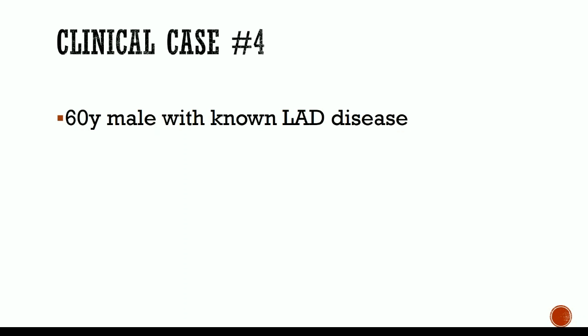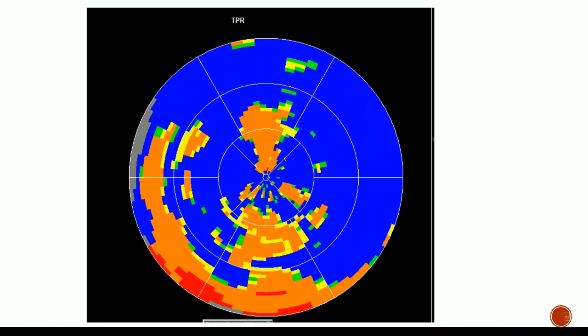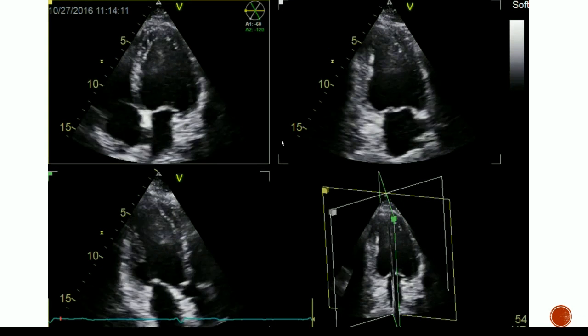This was a 60-year-old male with known LAD stenosis. This was his coronary CT angio, where, just beyond the diag of the LAD, we have some calcified segments in the area of severe plaque and severe stenosis right here. This is the CT myocardial perfusion Dr. Harrison was mentioning earlier, which looks at uptake in the myocardial tissue itself. Some of this may be artifact, but here in the anterior apical segment, we see reduced uptake of the myocardial tissue, indicative of reduced perfusion.